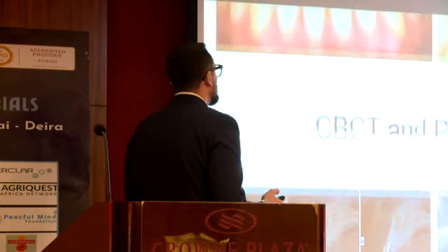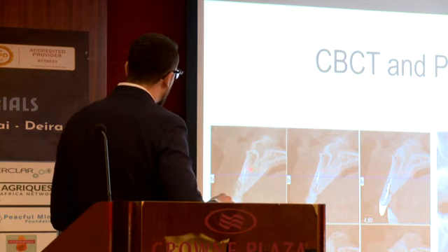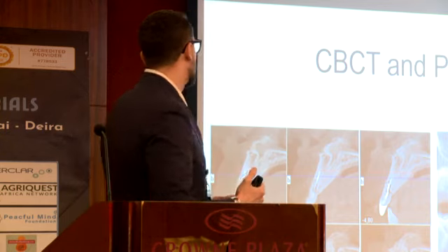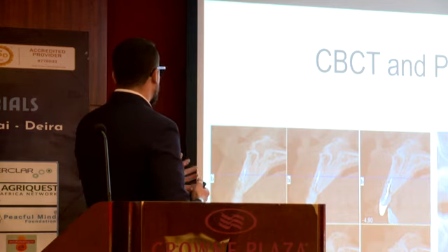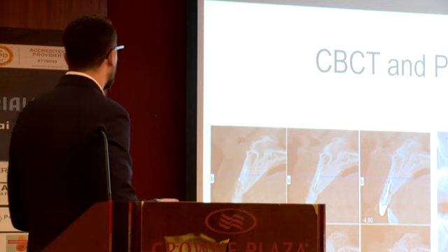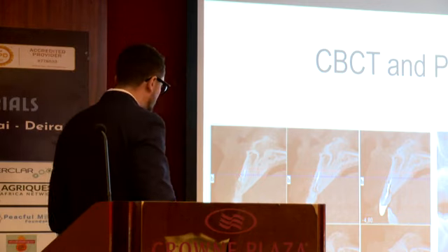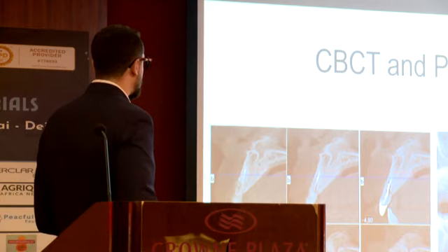So now we can take a look at the CBCT and panoramic X-ray. In the CBCT we have good residual apical bone. That's the bone we have to drill in order to place the implant and gain the primary stability needed for the immediate restoration after the implant drill. And we can talk about a class 1. Going back to the classification, we have a very thin buccal plate, but on the palatal side we have good bone, though we will also have to respect the nasopalatal nerve in the palatal aspect.